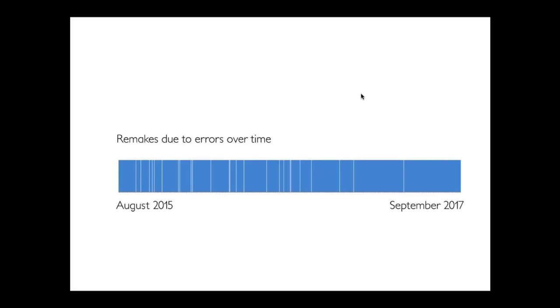When I talk to people about whether they need another try-in, I tell them, always start with making extra try-ins. And when you get to the point where you no longer are making changes from your try-ins, now you can confidently move forward with not requesting additional try-ins. And now, just to clarify, not all of these 481 orders are final dentures. This also includes try-ins and other products.